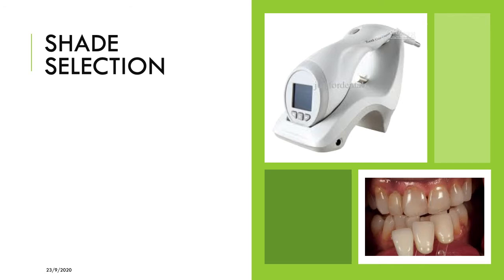After that you can take it, and there are a few functions. You can take the shades like cervical, facial and incisal, or just a normal shade. According to those settings you can fix it, and after that you just attach it to the desired tooth. For example, you just keep it next to that tooth and press the button on top, and it automatically says what shade it is.